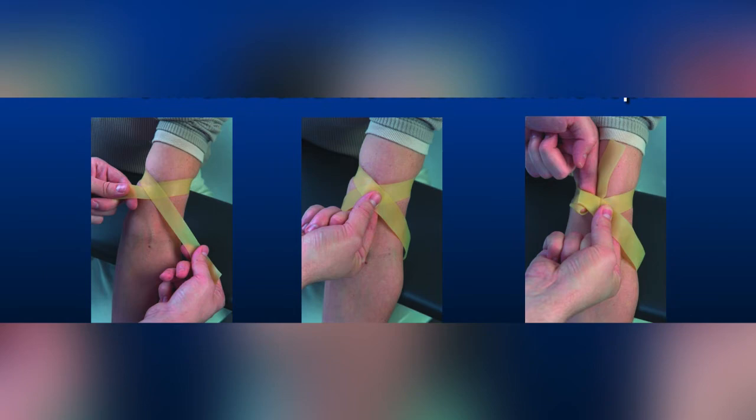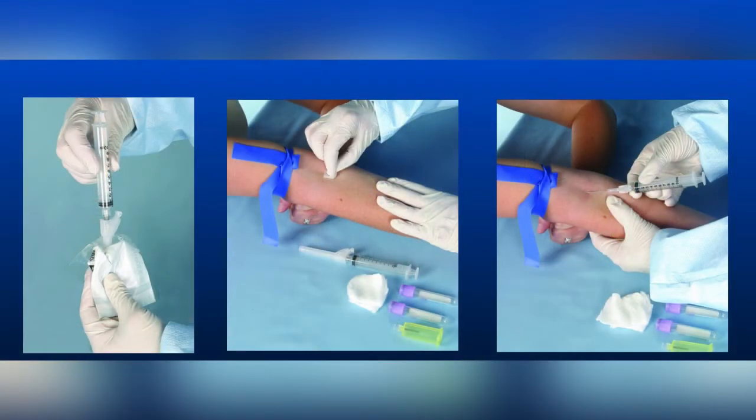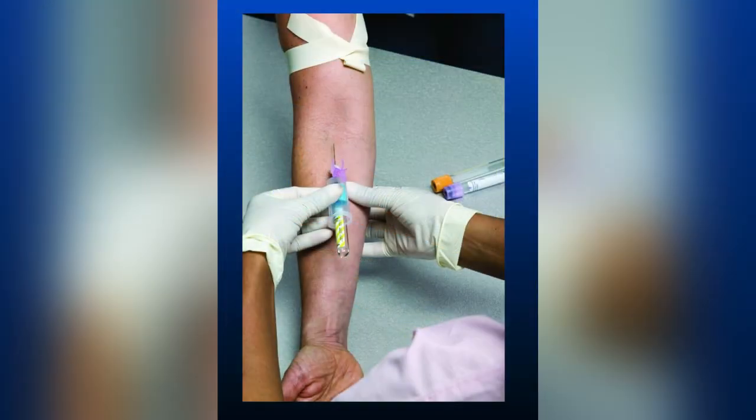Select vein, release tourniquet, ask patient to open fist. Clean and air dry site. Prepare equipment and put on gloves. Reapply tourniquet, uncap and inspect needles.